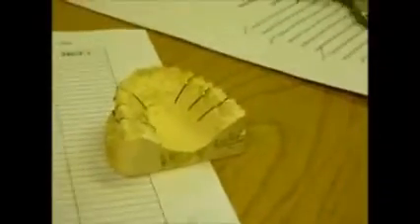It's just that they're perhaps short of some practice, some skill, or knowing which bits are going to score. The arch form right. And once you've got the arch form right, then you get the thing flat.